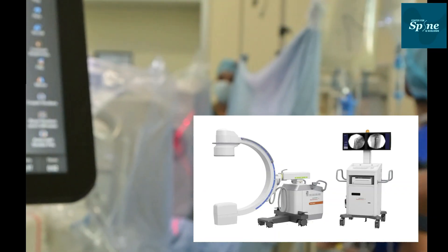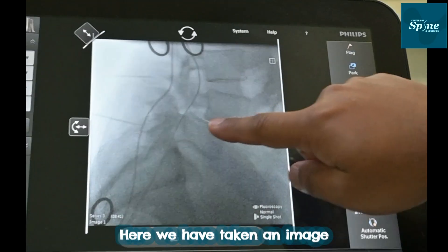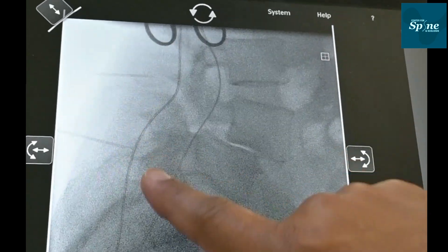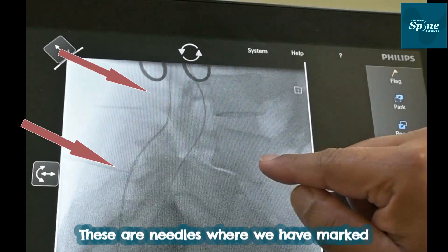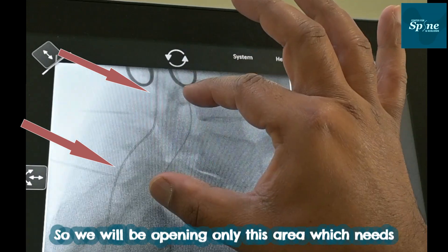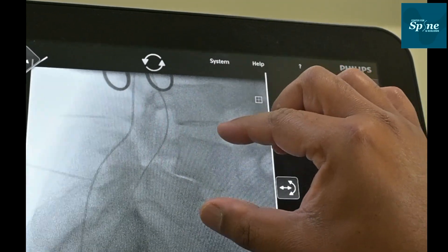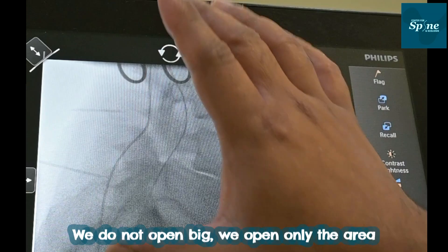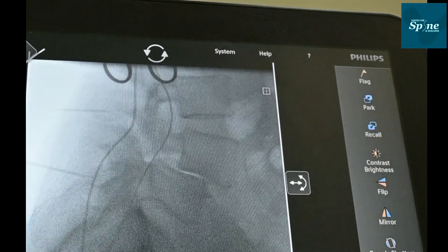This is a 3D CT scan where we have marked our level. These are needles marking where we are going to operate, so we will be opening only this area which needs surgery. These days we do not open big — we open only the area of interest.